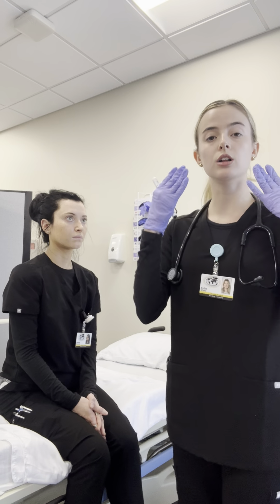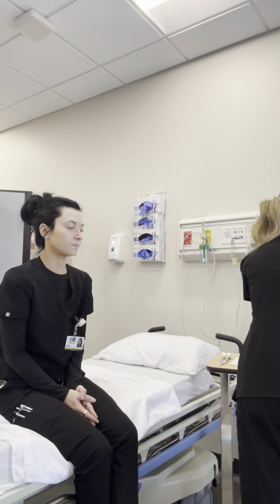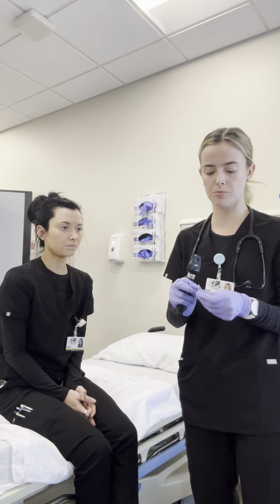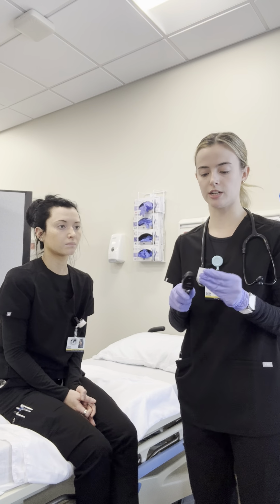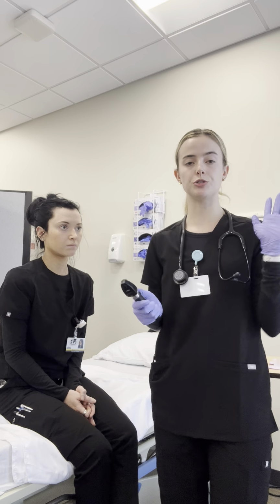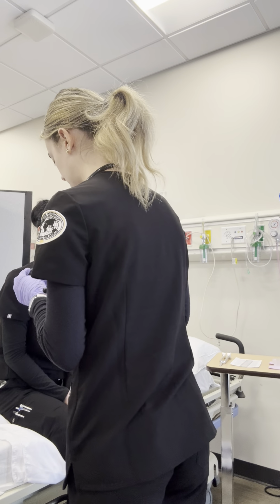Now I'm going to look inside the eye. Visually, it's pink. So I'm going to clean my ophthalmoscope with an alcohol pad, just in case it were to touch the patient. And to do this, I am going to place my hand on their shoulder to ensure we don't move heads. Are you okay if I place a hand on you? Okay. We are looking inside the eye.